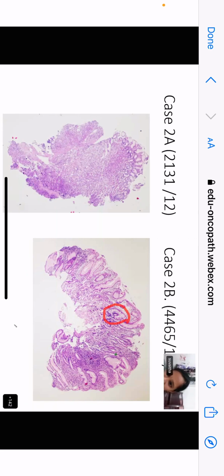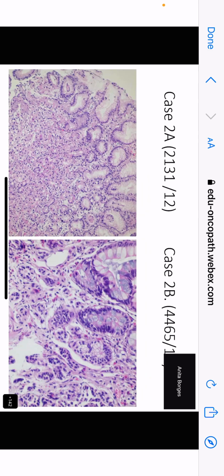Now, what do you mean by intestinal metaplasia? What are you seeing, Shweta? Goblet cells in the gland. Which is so obvious. The rest of this foveolar epithelium is plain, simple, mucin secreting, non-goblet cell epithelium. And this one, a portion of the foveolar epithelium is sticking out over there, right in the center, and it has got goblet cells.